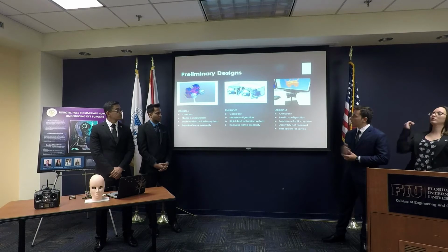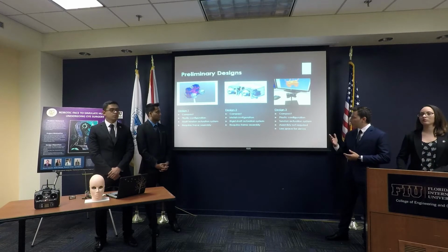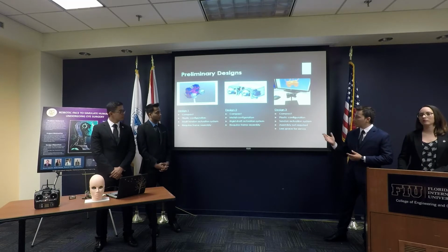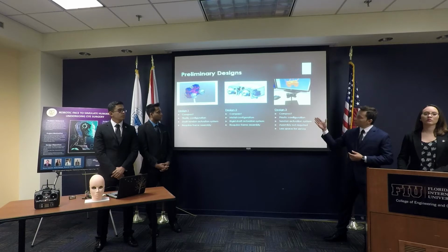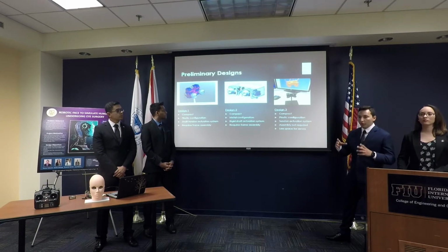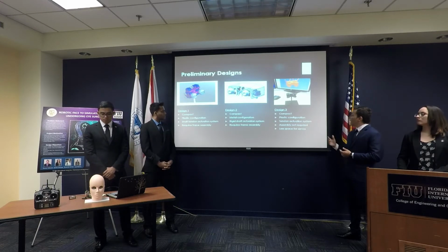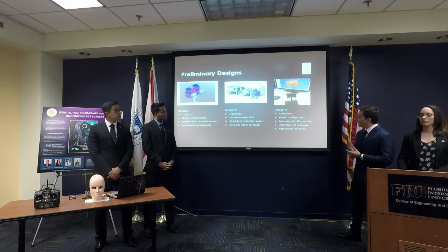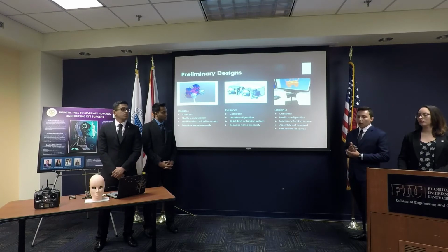The second design is made of metal. It's also compact, but this one also requires assembly, and it uses a rigid shaft actuation system. The last one is almost similar to the first one, but this one we actually printed to see how the dimensions would fit in our face, because that was one of our boundaries. As you can see, it's a compact design, also made of plastic, but this one does not require assembly.